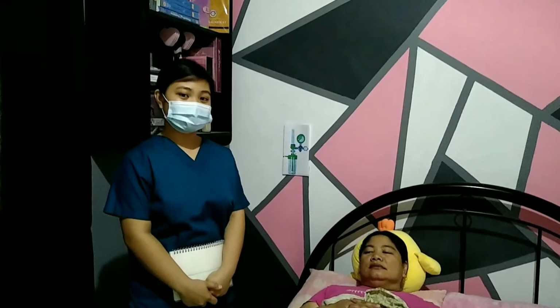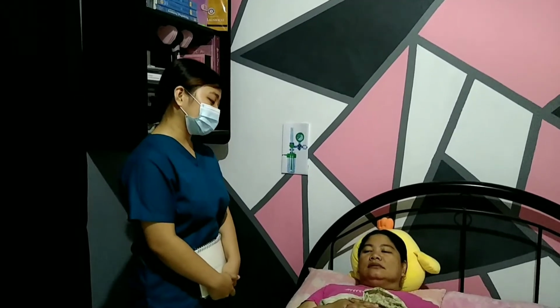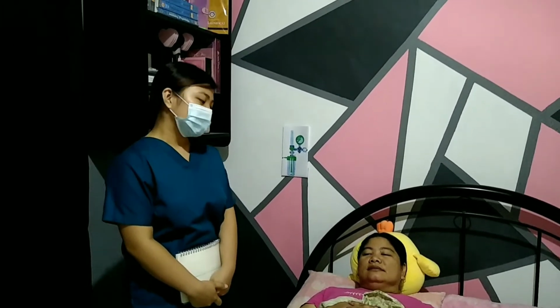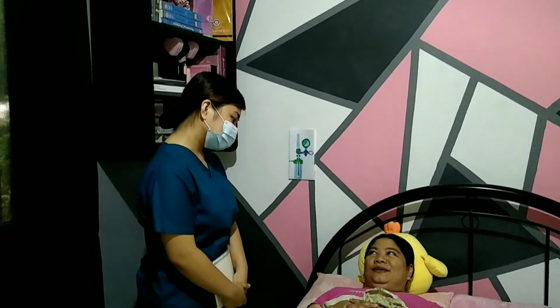Okay, and then observe for behavioral changes also, and observe for patent airway and remove airway secretions by having the patient cough or by suctioning. And of course, don't forget to ask permission of your client to cough. Okay, ma'am, can you please cough? Okay, ma'am, thank you so much.